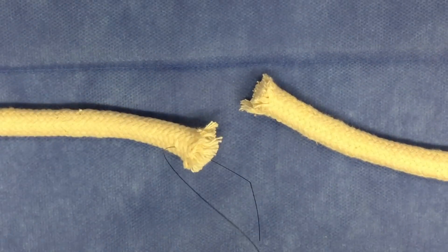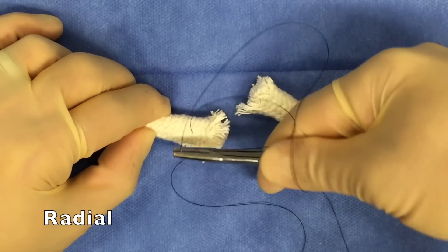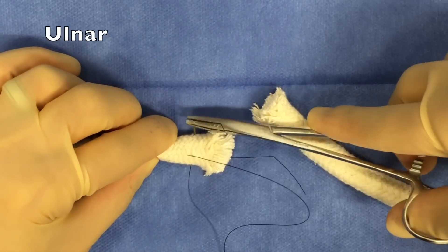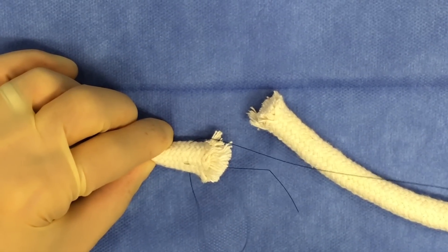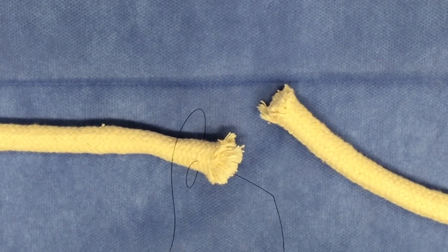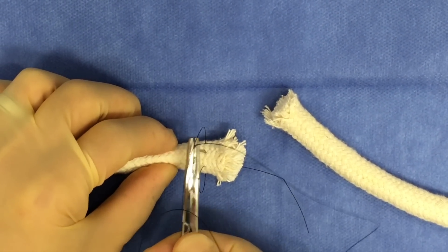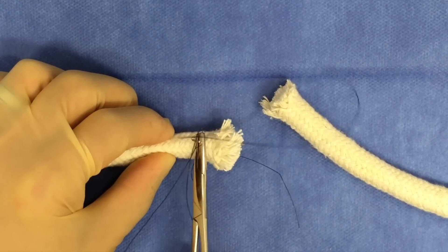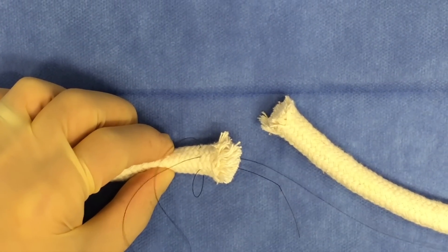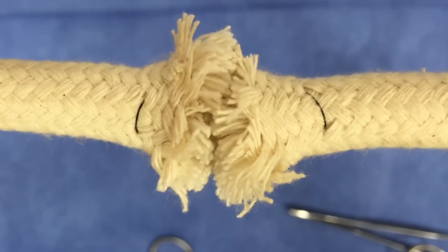Let me show you one variation that's commonly used in the literature. The first pass is the same, but instead of threading your suture needle behind the tendon, you're actually going to suture through the ventral aspect of the tendon itself. Your next throw, however, will be no different than what we just showed: you're going to go through the dorsal aspect of the tendon, the exposed edge of the tendon, and come out at the cut end. You'll complete the exact same pattern on the other side in order to bring the ends of the tendon together. The final appearance has less of that suture being exposed on the outside of the tendon.